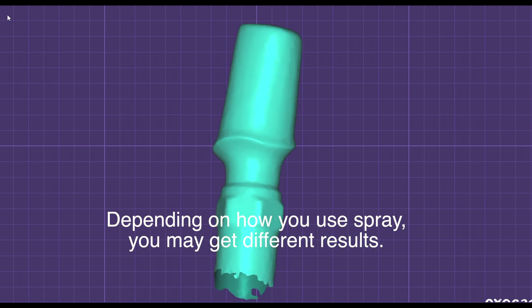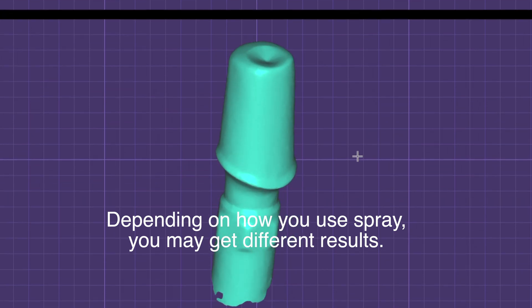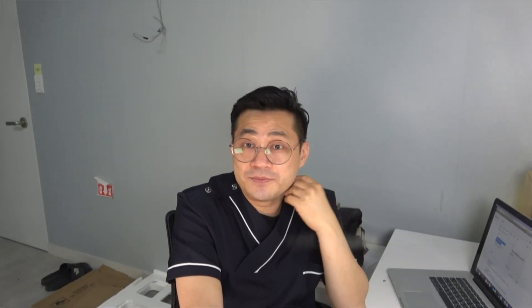Depending on how you use the spray, you may get different results. How do you think about my opinion? This is just my opinion, so this would be true or not — but I think this method is worth trying.